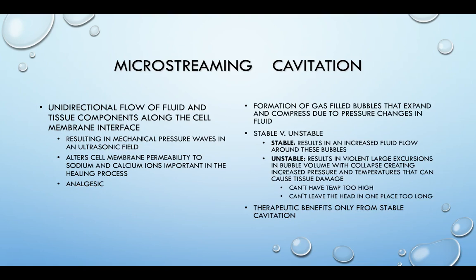Cavitation are bubbles. Okay, so cavitation is due to the changes in pressure, those peaks and troughs, we get an accumulation of gas, and actually these microscopic bubbles form. When that is happening, okay, and they expand and compress with the pressure changes, when that's happening in a really stable environment, we get these pulsating bubbles that are then going to have these effects on the healing process of the cells as well. Okay, so those bubbles help to increase the microstreaming effect and to do all those things that we just talked about.